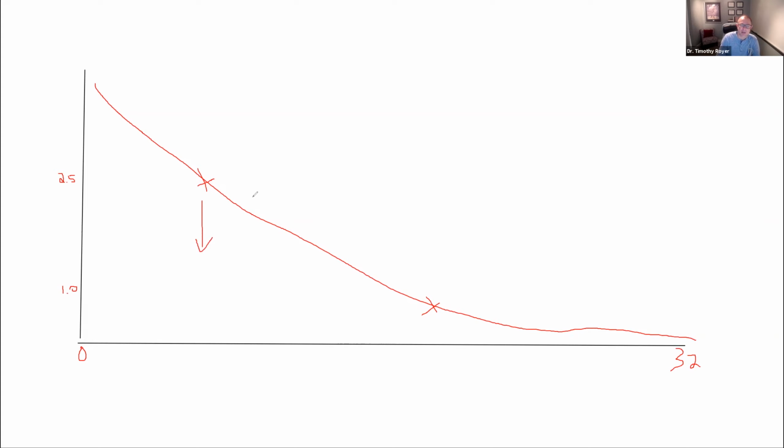But as that pitch gets low, we start to see these parasympathetic issues. And on the flip side, the other one I want to talk to you about is what happens if it starts to rise. That means I'm getting more theta and less low beta, or 16 to 20. Then I'm getting something like this. Let's go with a green line.